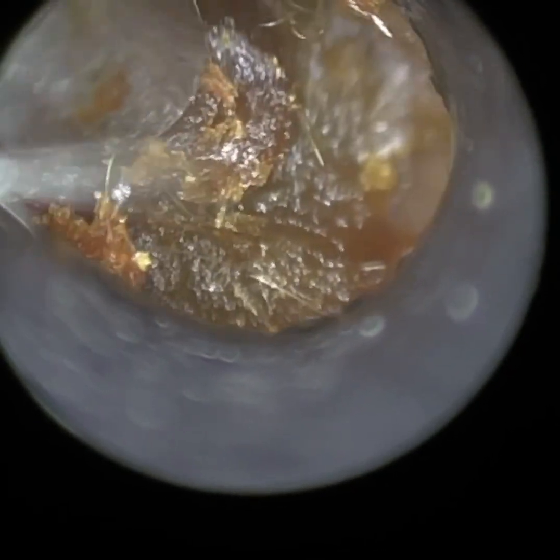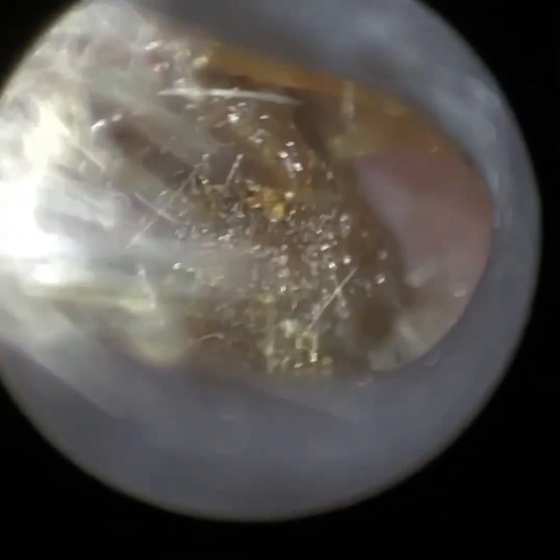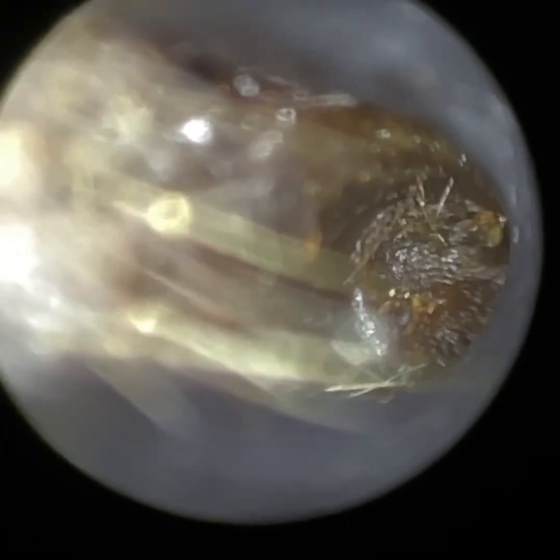I think this ear gave a bit more difficulty than the contralateral ear. And they had been using a cotton bud — you may have seen there was an imprint of the cotton bud just where we're looking at now. I've just put some oil in.